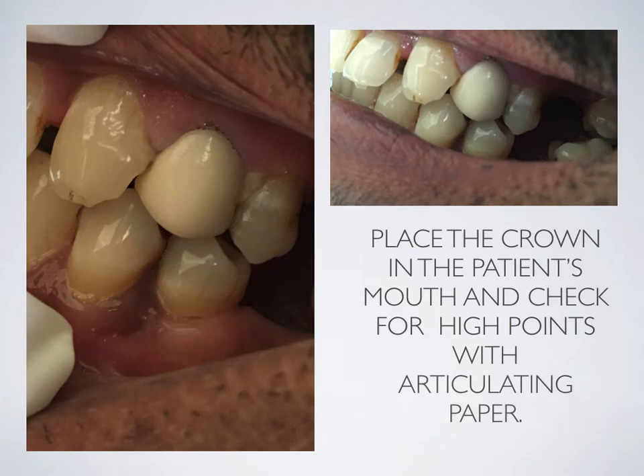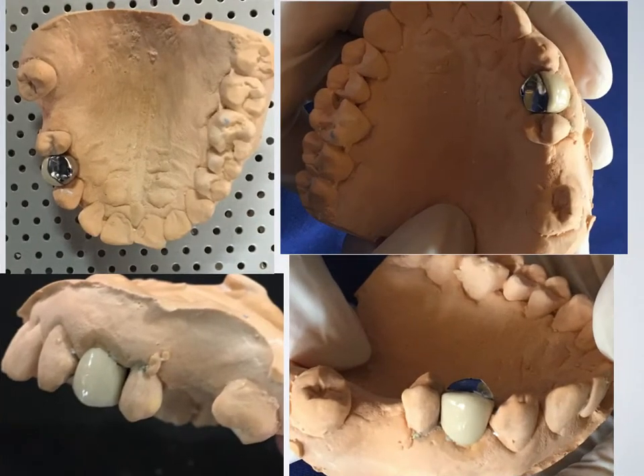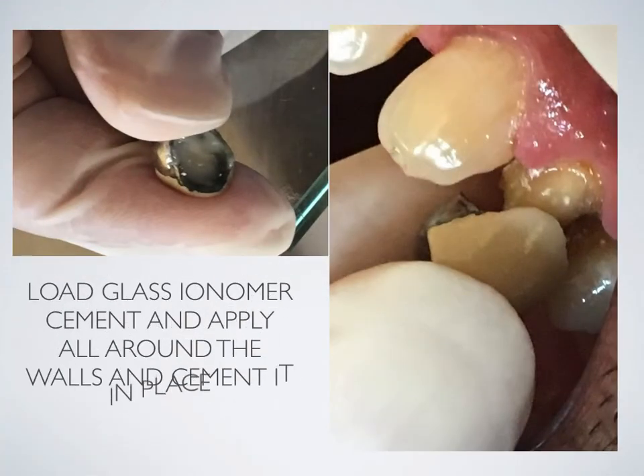Place the crown in the patient's mouth and check for high points with articulating paper. Trim the high points if any — again, for gross changes, resend it to the lab. Post-glazing, the ceramic and polished metal appearance is shown. Load glass ionomer cement and apply it all around the walls and cement it in place.